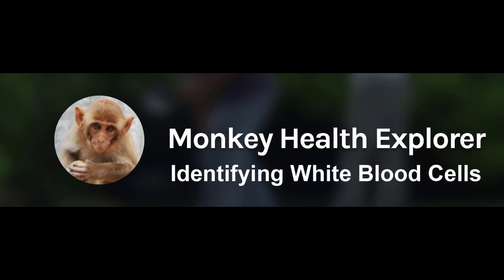Hello volunteers! Welcome to this brief tutorial to help you participate in the Monkey Health Explorer project. The main objective in our project is to count and identify white blood cells in rhesus monkeys. This will help us understand which monkeys may be sick and which are healthy.